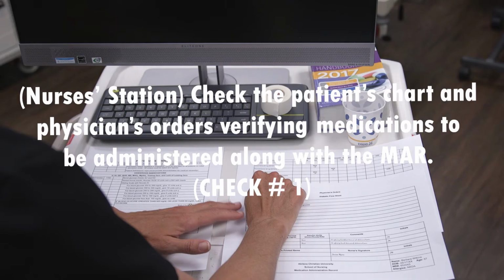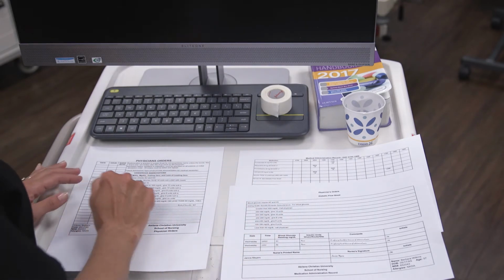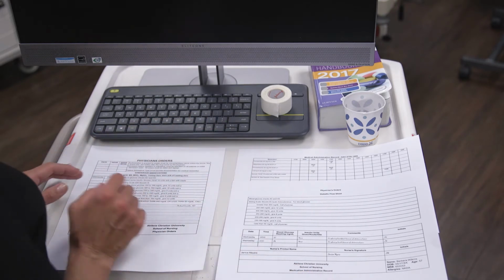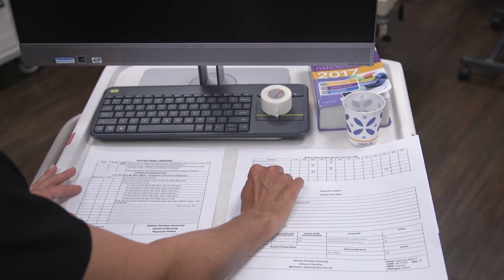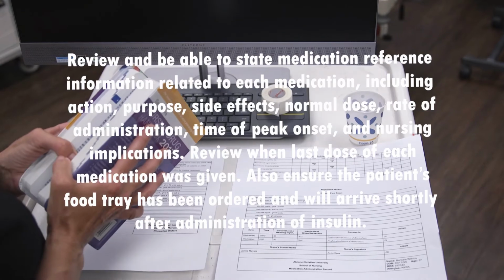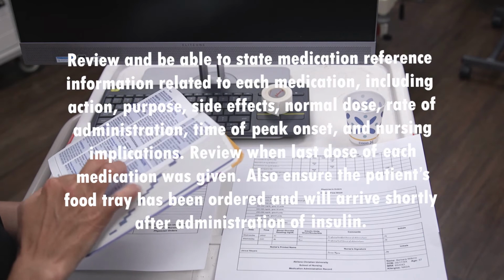Check the patient's chart and physician's orders, verifying medications to be administered along with the MAR. Review and be able to state medication reference information related to each medication, including action, purpose, side effects, normal dose, rate of administration, time of peak onset, and nursing implications.